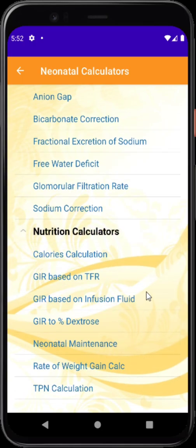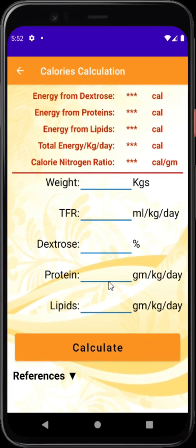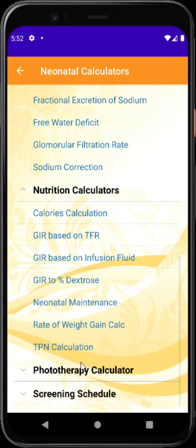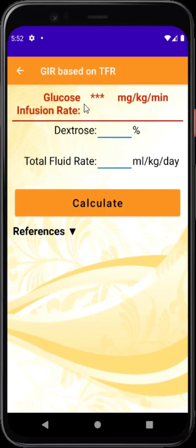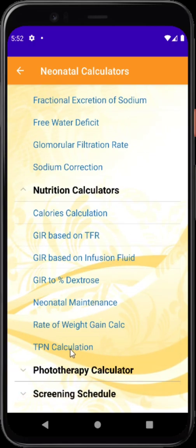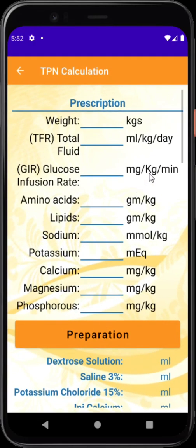Metabolic calculators are followed by nutritional calculators, which are very essential in any level-3 neonatal unit. You can use them for calculation of calories given the fluid content, and for calculation of GIR (glucose infusion rate) based on dextrose and total fluid rate. I would like to concentrate here on TPN calculation, which is one of the most intensive jobs we do in neonatal units.